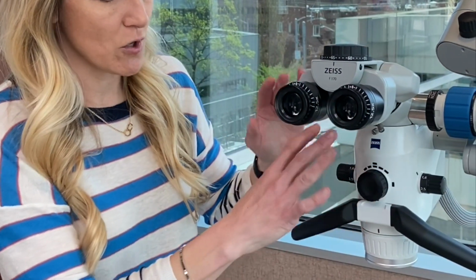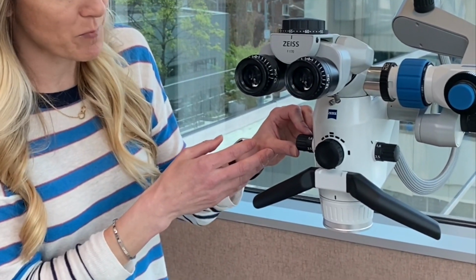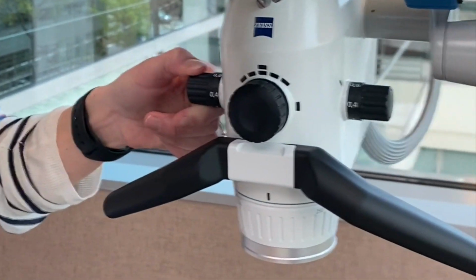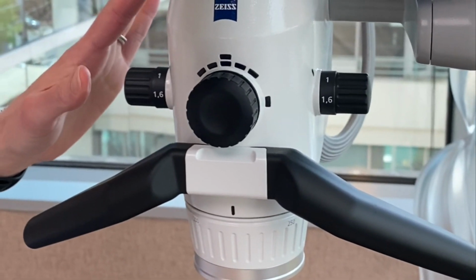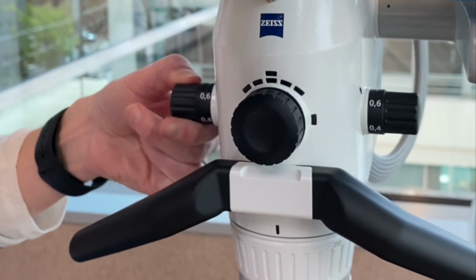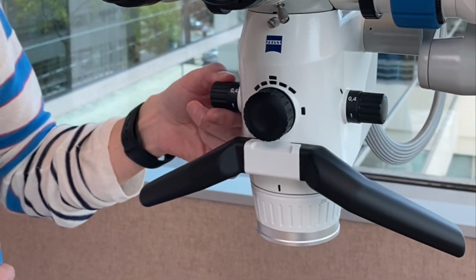All right, we're going to go down to the main body of the scope. This is the second big section here, and we're going to look at this part. It's a dial on the side called a magnification changer. This scope has 6 different steps on it, 5 different magnifications. If you look closely, there's a number on there, and these numbers are a factor of the magnification, the true magnification.